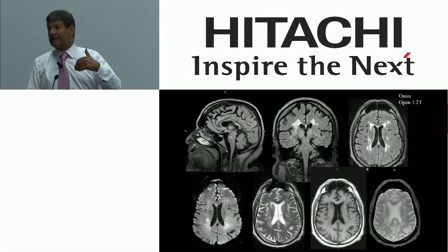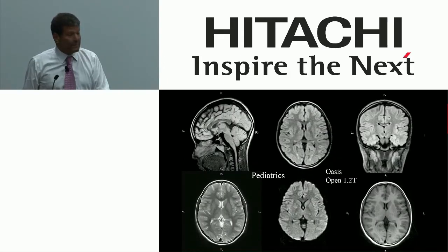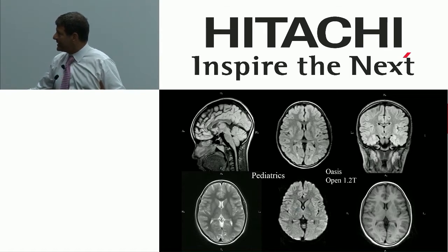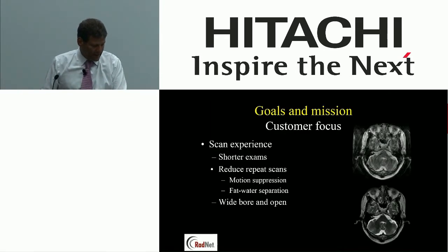Other practices, when they do multiple sclerosis, are going to do 2 planes. In those practices, they use 3D for those planes. So it's a nice thing. In pediatrics, when you want to get that scan over before the patient loses tolerance, 3D imaging across the board. This is one 3D scan. And again, beautiful diffusion, really beautiful high field quality images, leaving nothing to be desired.